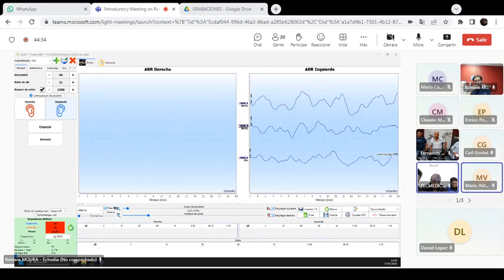Okay, sorry to interrupt you. Just want to point out that in the packing list, I see a bone vibrator. Is it the one you're looking for? Yes, maybe. Exactly. That's it. If I could share the packing list, there is a bone conductor in the OAE screening devices. And the bone vibrator in the other package.